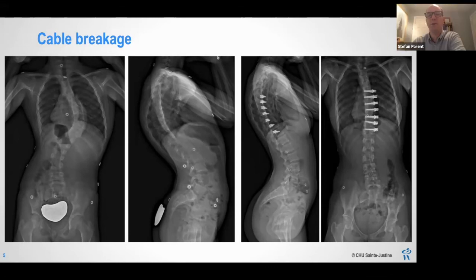Yeah, you're able to line up a case like this and get it right at the right time with the right growth spurt. She was growing very rapidly at that time, going through a growth spurt. So putting the cable in, not having to wait a year or 2 for the growth spurt to kick in, and then she would correct. We maybe got just very lucky. She had a long growth spurt, from 9 to 13, and she did correct over time. And then looking back, having the guts to go back at that time, I can tell you the night before the revision, I wasn't sleeping that well. I heard all these crazy stories about people having to revise these, and it's not an easy surgery to revise. But if you're able to do it, then yeah, no question.